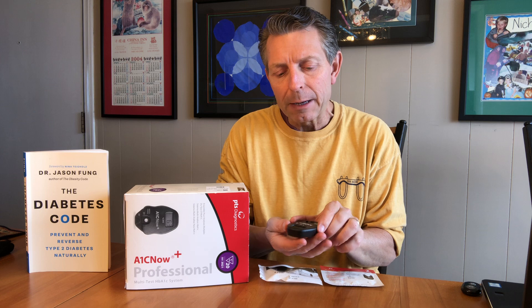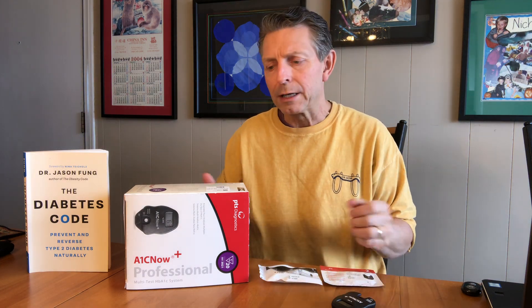What we can do here — I'm going to show you the particular A1C reading. I want to introduce you to A1C Now, and you can see here the A1C is 5.4. That was an A1C that I just tested on myself, but I want to show you a little bit more now about how to do this.